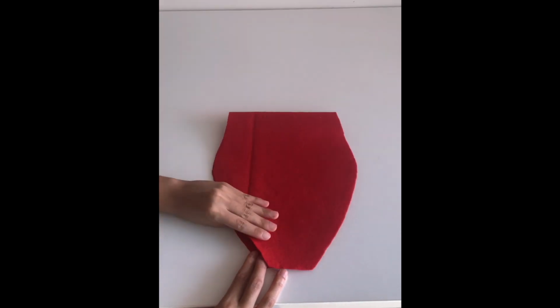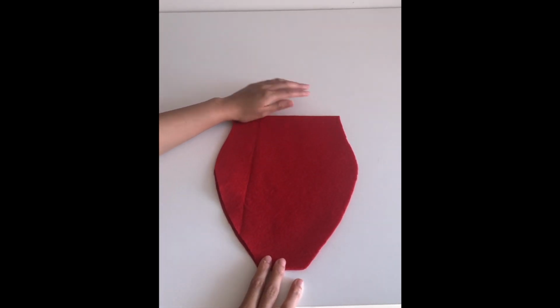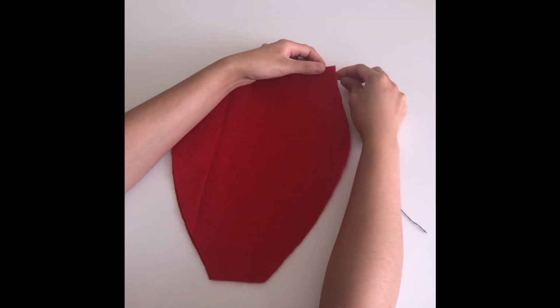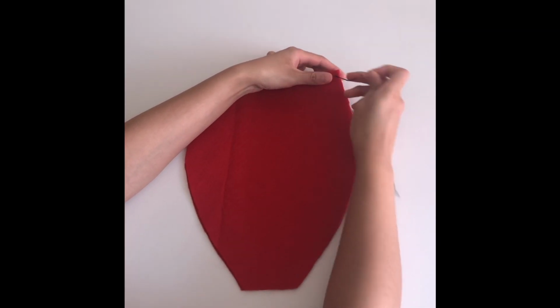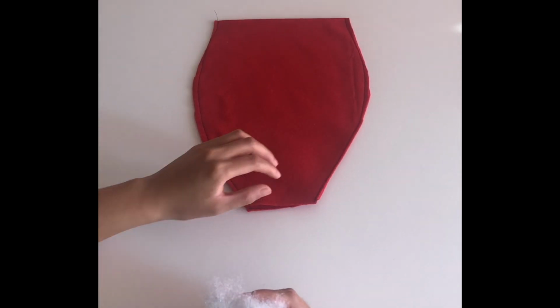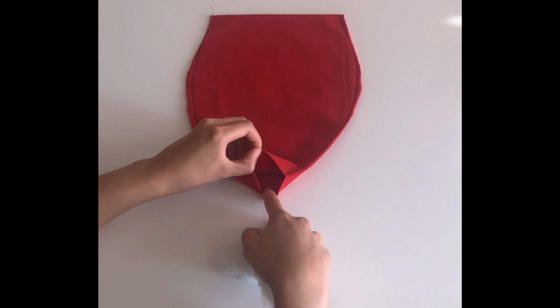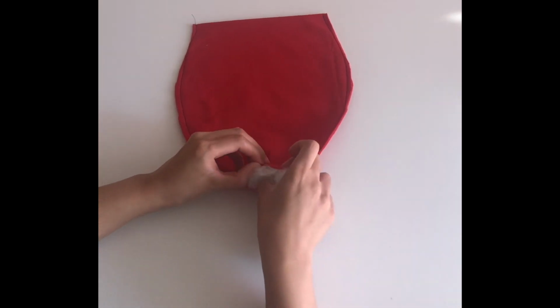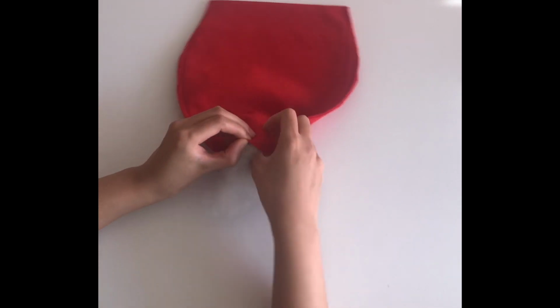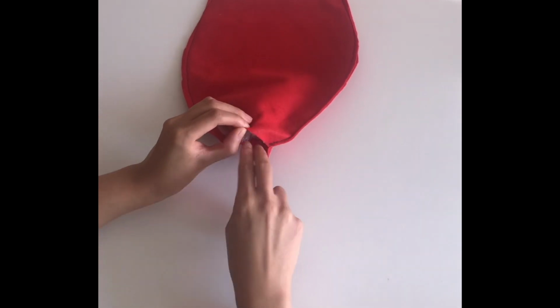Next, fold the uterus shape in half. You will sew along the edges to close the uterus. Keep the bottom end of the uterus open for stuffing. Fill the uterus shape with stuffing until it is completely full and almost bulging.